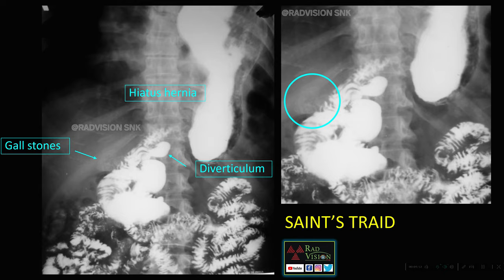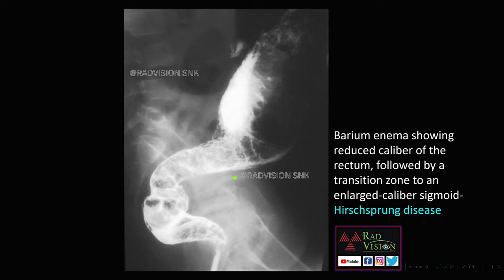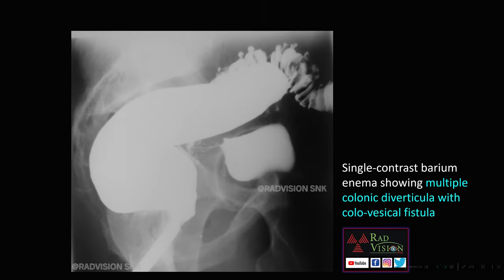Here you can see a barium enema showing reduced caliber of the rectum, a transitional zone, followed by enlarged caliber of the sigmoid colon. Whenever you see diffuse narrowing of the rectum followed by a transitional zone and then enlarged caliber of the sigmoid colon, definitely suspect Hirschsprung's disease. This is a case of Hirschsprung's disease.